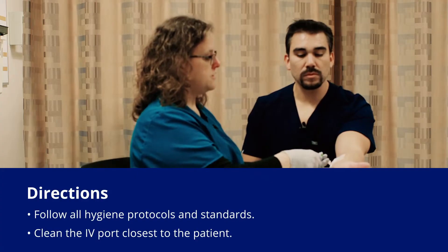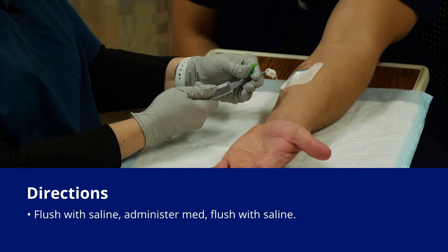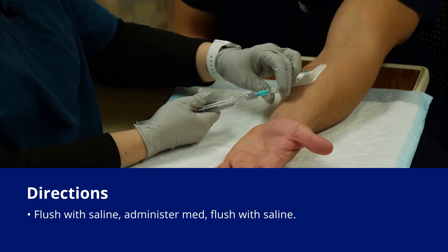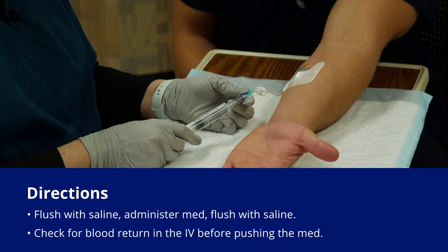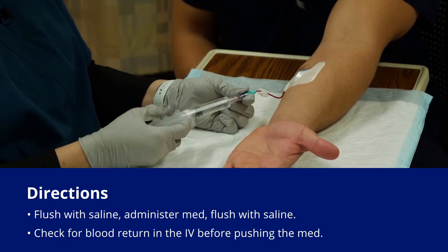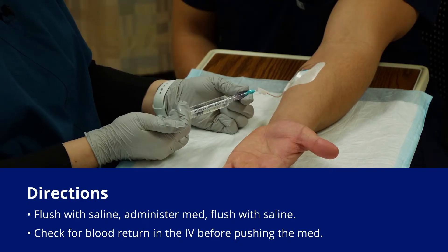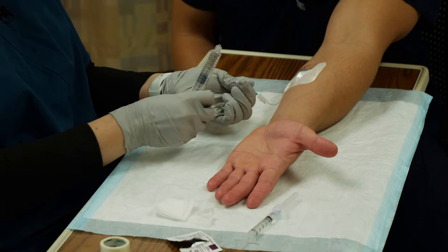Now I want to do a little bit of saline first, so I'm going to attach to the luer lock and unclamp my IV. If you have a fairly fresh IV you should be able to get a little bit of blood return, so check that and then give just a little bit of saline. That just makes sure that your IV is actually patent.